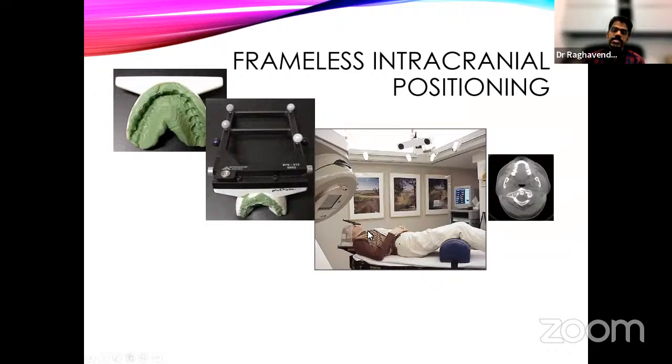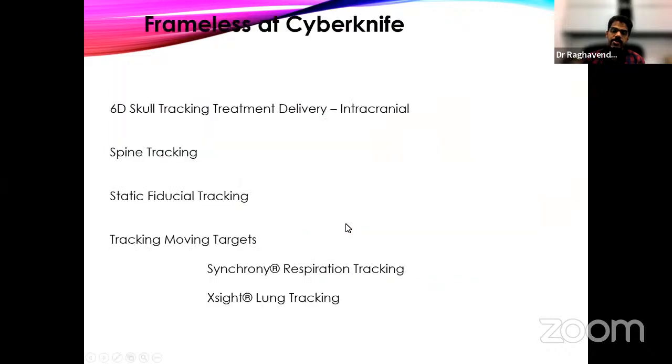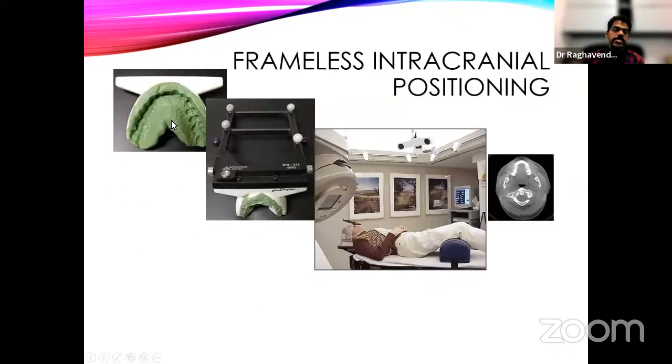Like that, there is another system, like Elekta gives you something like a dental one, but to that dental one they give you a vacuumized system where you can suck the vacuum and make sure that this dental fixture is fixed properly to the upper palate of the patient, and on top of that you fix a localizer so that the patient is rigid at the time of simulation as well as during the treatment.